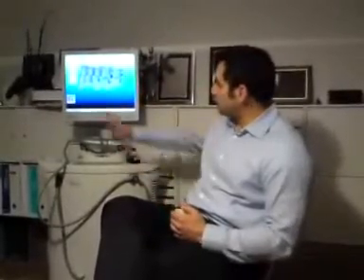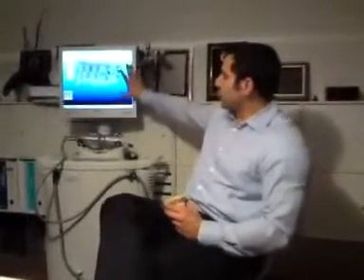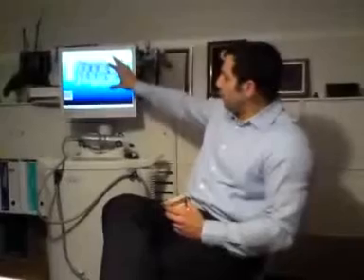We do have the application for the doctor to be able to give some input and discuss and chat, but we always give the lab this final seal of approval before they authorize the milling of the models. So, because we have the dental designer from 3Shape, the design platform, we'll just import this file. This is the clinical software. So what happens at this point is once this is sent off and processed, it'll then show up as a new case in the laboratory software. Yeah. Then you'll click open the new case, and then you'll review the case. The margins are generally picked out, selected, and found. Okay. Then what's going to happen is you would modify anything that you want there.